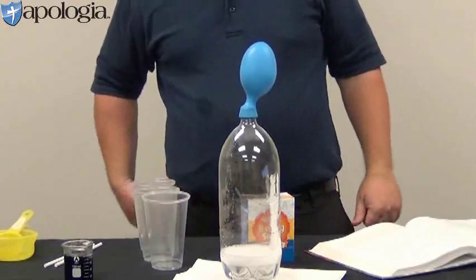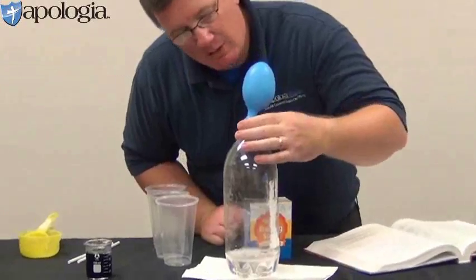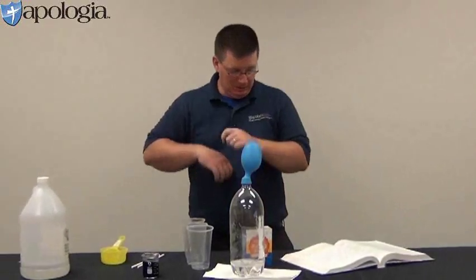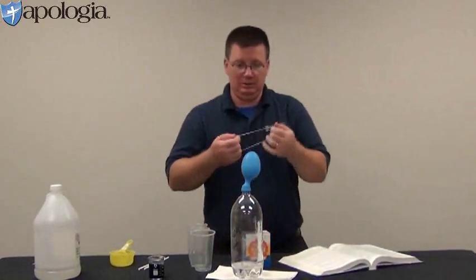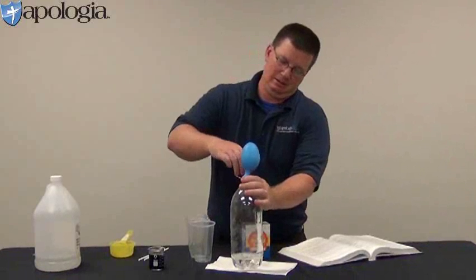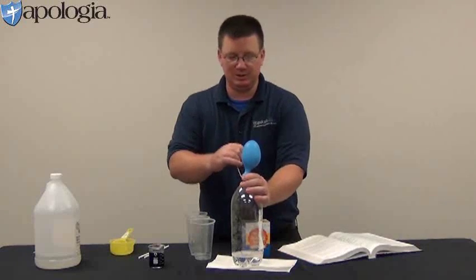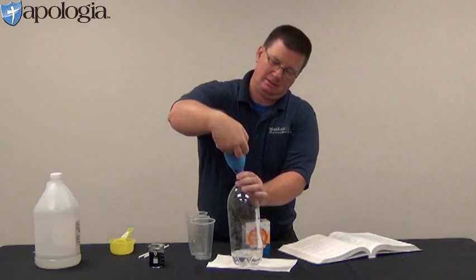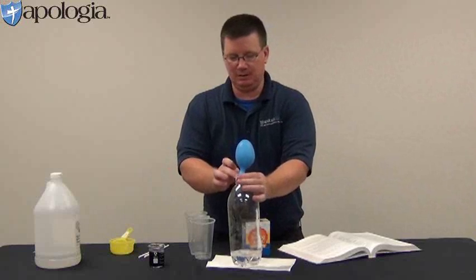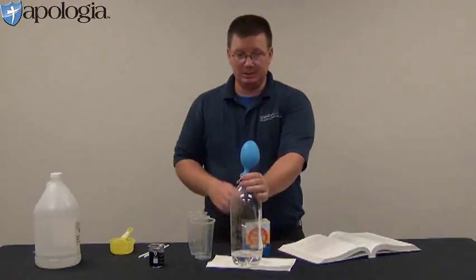As long as that's got inflated there, that's okay. Check for leaks. See if you can hear any leaks. If you are hearing some leaks, you can squeeze it off here. If you have a rubber band handy, you could take the rubber band and put it around to make it nice and tight so as not to lose any. I don't think I'll need to do that here, but just for precaution's sake, I can. The balloon will help make sure that there's no leaks, and we don't want that to go anywhere. So we're going to let this sit. It says for about 3 minutes.